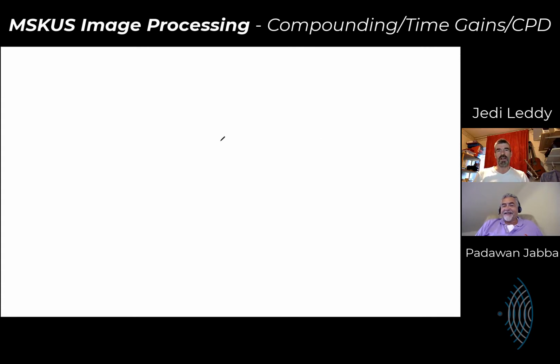So you have a grayscale that reads 1 to 20, maybe, or 1 to 200. Lots of different levels of brightness, from white to black, or black to white. But let's go black to white. So 0 or 1 is a tiny amount of reflection, and 20 would be a lot of reflection. That can be an absolute scale.